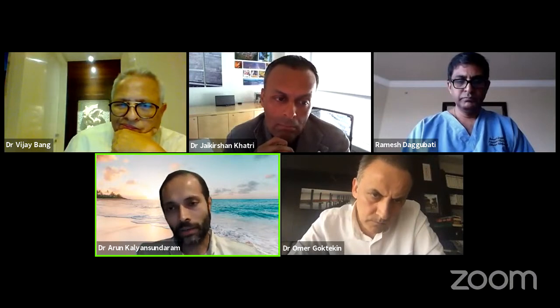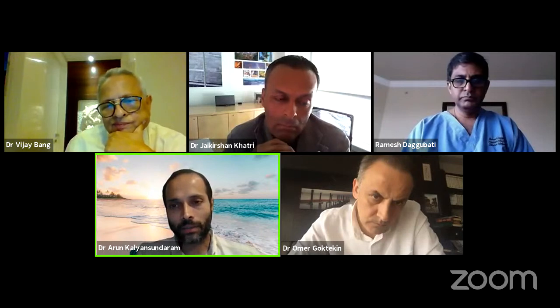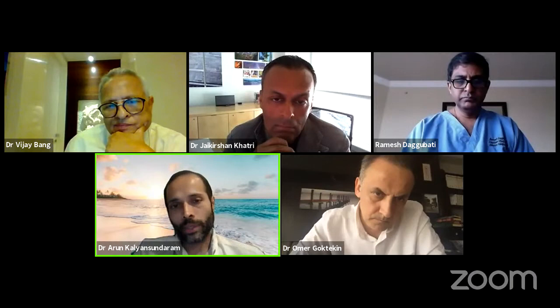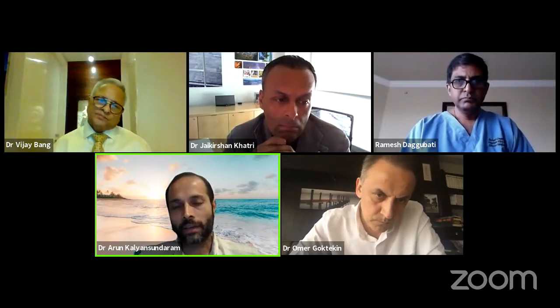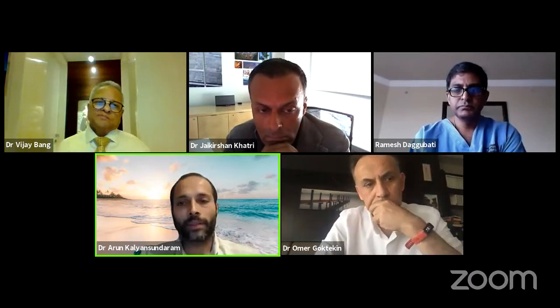Yeah, there are a portion of cases where you end up just starring it, bringing them back in about 6 weeks to readdress the whole issue. Because the worst thing you can do is persist and end up in a needless complication. I think the biggest lesson, and Jay kind of hit the nail on the head earlier, is that knowing when to stop and avoiding complications is probably even more important than your success rate.